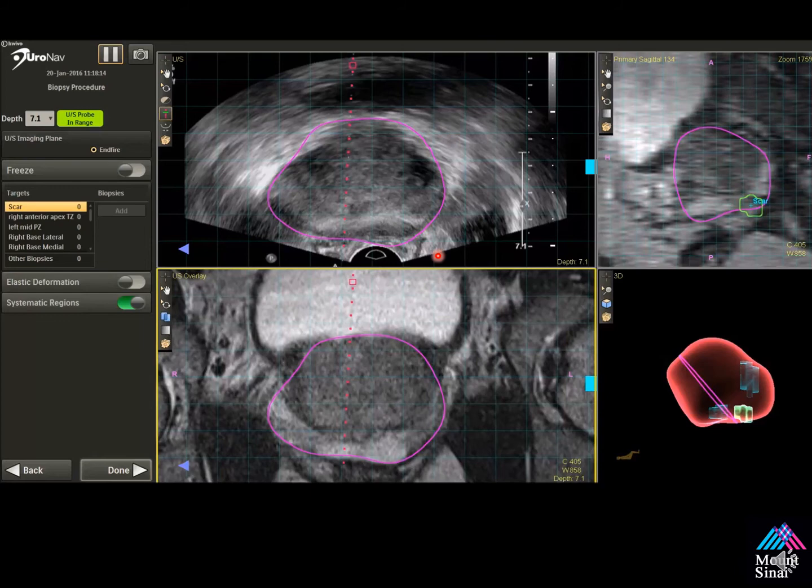Notice the outline — watch the prostate the whole time. I adjust my pressure posteriorly, but I'm always checking the anterior border of the prostate. This is extremely important — this is how we're able to perform targeted biopsies with prostates that may not be exactly the same as when the MRI was obtained. The better your MRI, the better the pictures will look in the bottom screen. If your MRI is not scanned perpendicular to the posterior border of the prostate, you're going to be off angle. I prefer end-fire because you're able to look sagittally and axially with just rotating your hand. With a dual planar probe, you have to readjust your pressure because the crystals are not in the same place.